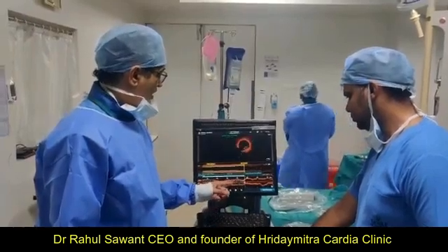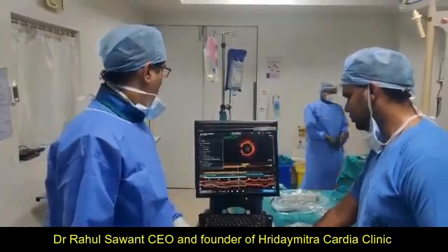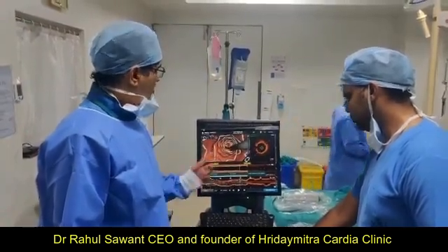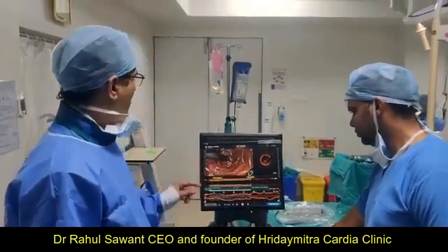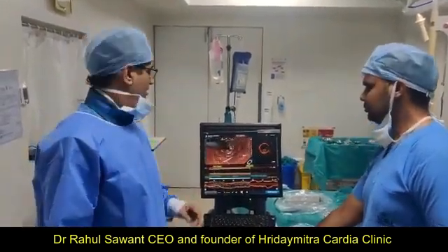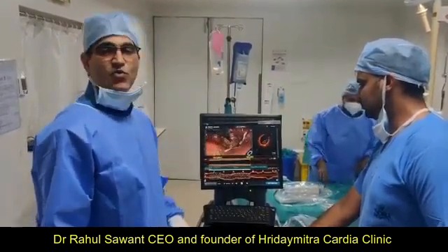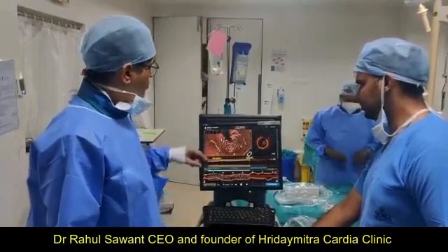You can also see this stent in a three-dimensional view. This is the three-dimensional view — you can see inside the vessel as if you are going inside it. You can see the stent struts, and this pink area is the vessel wall. You can see the stent is very well opposed.